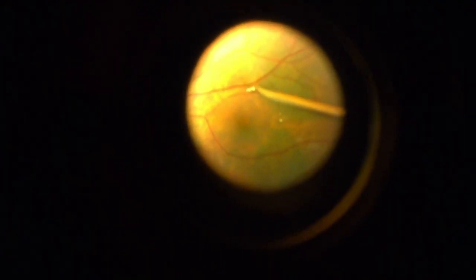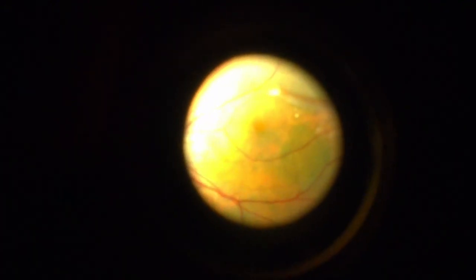So I like to use this little pick to start an edge. And you can see we got one there. Now look how I kind of use the pick sideways almost, right? I like to use it sideways, not point down, but almost brushing with the broad side of the pick. You don't need the pick to be sharp. You just need some type of surface to engage that little ILM.